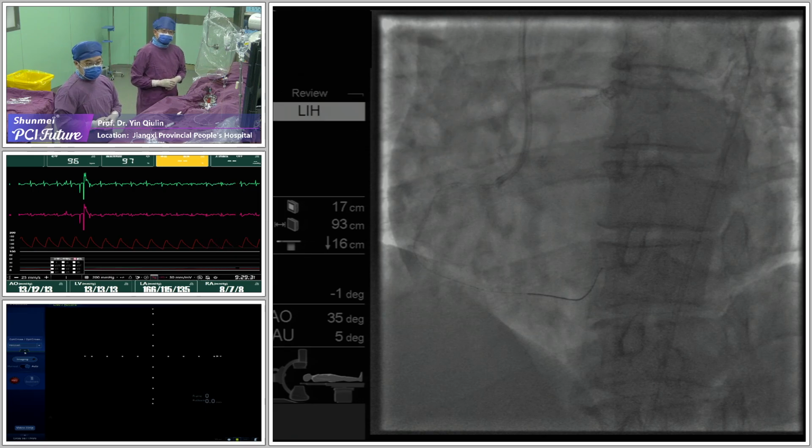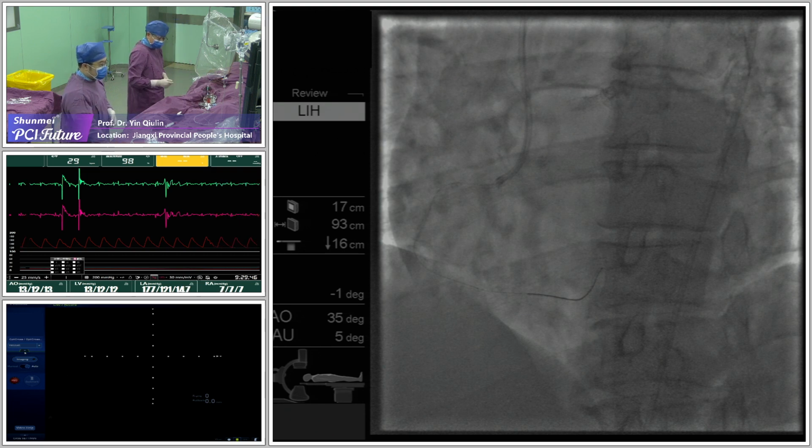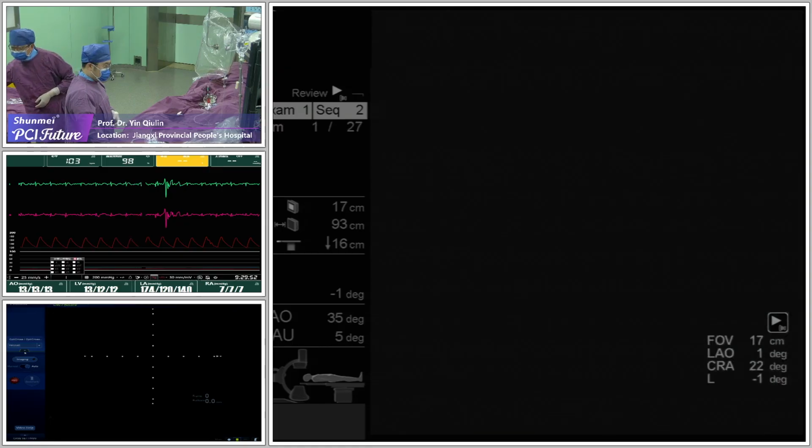Because here your guide wire is moving like you are already not in the vessel architecture. So I'm not sure that from the start you are inside, or outside the strut. I think this is a side branch. It's not right. Yeah, but you see your wire is too free from the start.